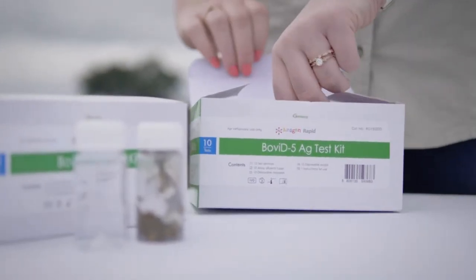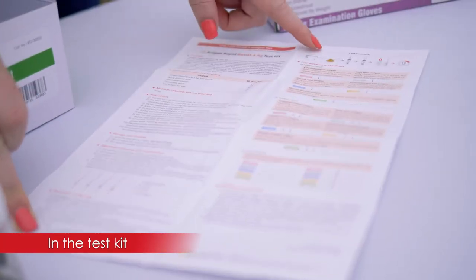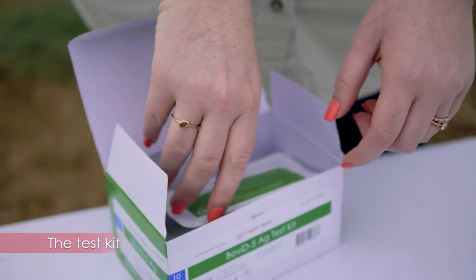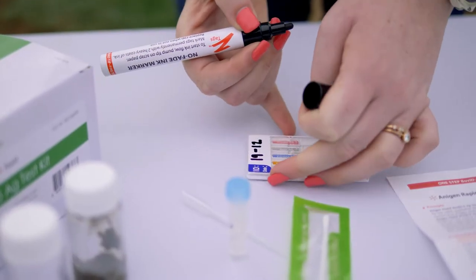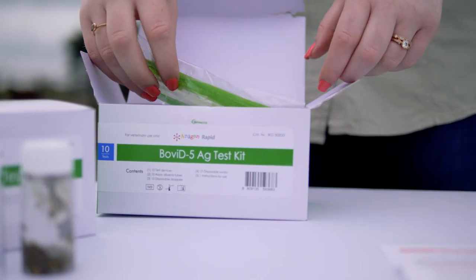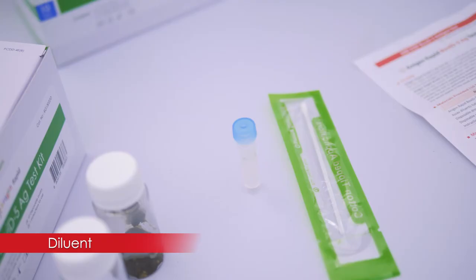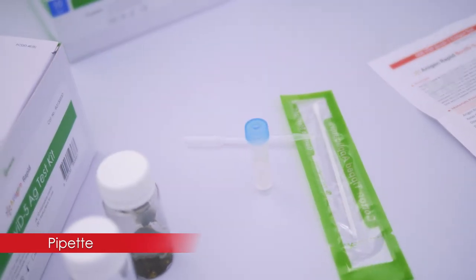So firstly, what is in the test kit? You have your instruction manual, and I will always recommend that you read through it so that you know you use everything correctly and don't get false results. Then you have your test kit itself. In the test kit you'll also find your swabs, your diluent, and your pipette, which you'll use to collect the sample to add to the test. Once you have everything ready, you'll obviously need your sample.